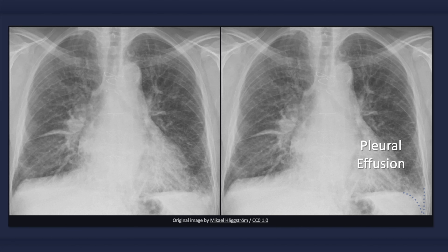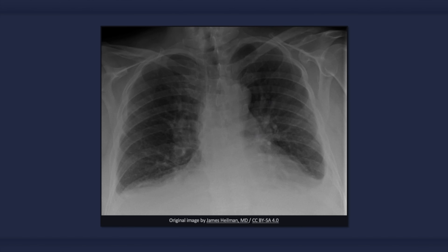In the bottom right corner of the radiograph, note a decrease in definition of the left costophrenic angle, consistent with a pleural effusion. Here is another X-ray of congestive heart failure. In this case there are bilateral pleural effusions, identifiable by the loss of costophrenic angles and obscured hemidiaphragms. Below the left lung we see the meniscus sign, in which the opacity has a concave upper border and is higher laterally than medially.